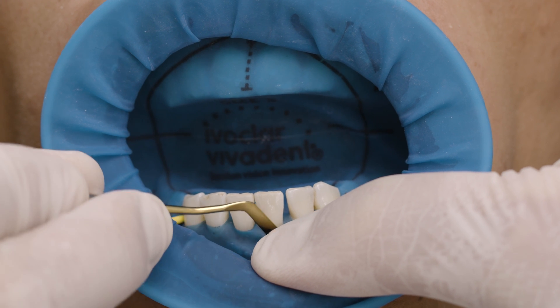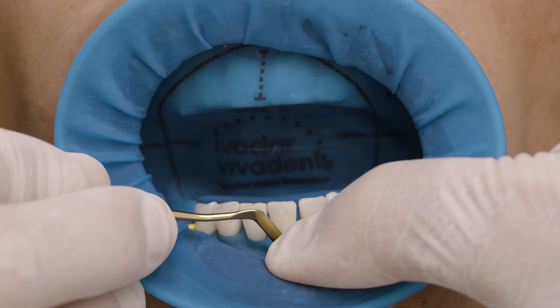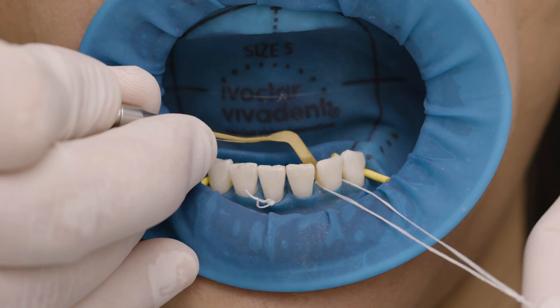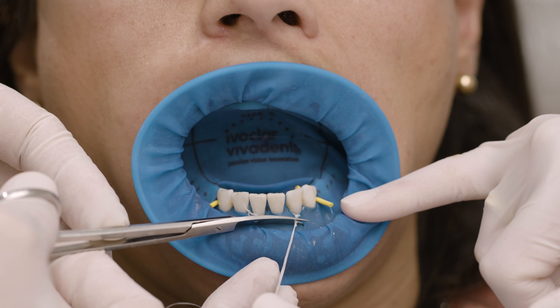If necessary, tuck Optradam into the gingival sulcus. By applying ligatures of dental floss, the rubber dam is pulled towards the gum line and fixed, which is important for proper isolation of the cervical area.